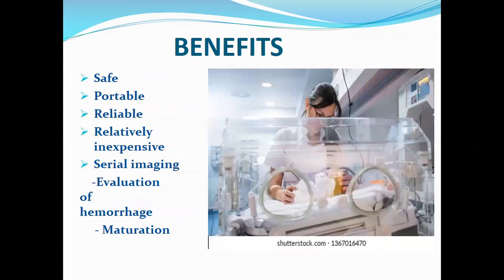The benefits of these scans? Well, it is safe. There is no radiation involved. Ultrasound is portable. Statistics say that when you move these infants a lot, their conditions exaggerate and they become worse. So it is to their benefit when you follow them to the wards, to the NICU.